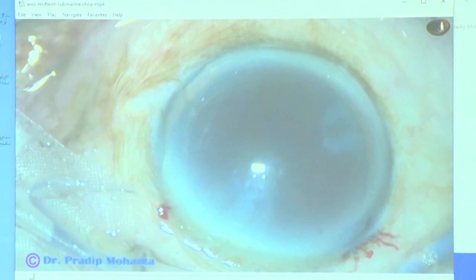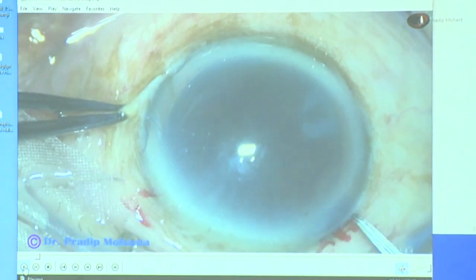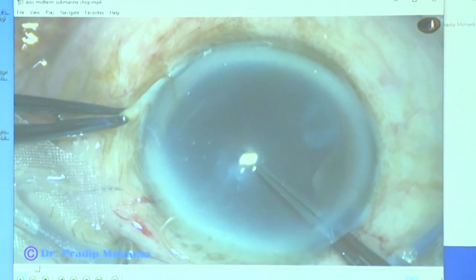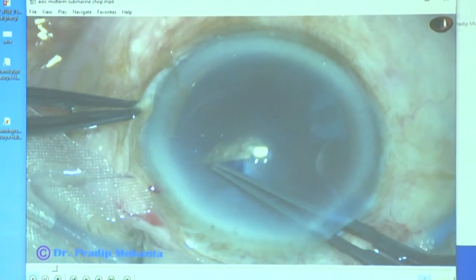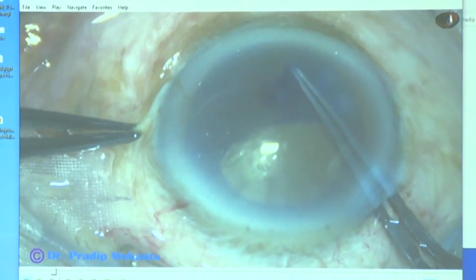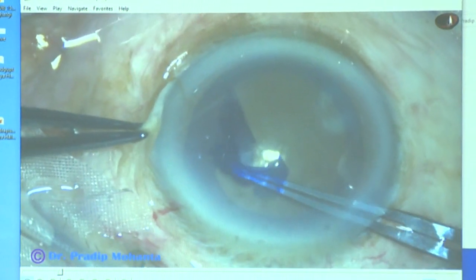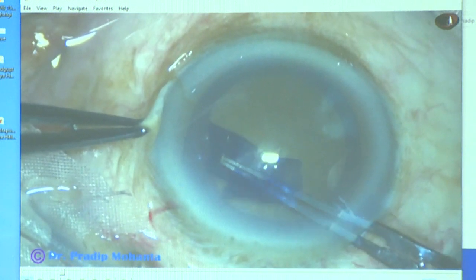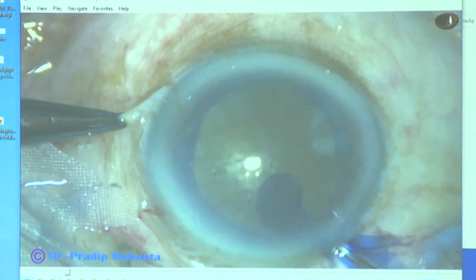For submarine chop, after making the incisions and for better visibility, applying some visco over the cornea, we need to do a large rhexis. Size of the rhexis should not be less than 5.5 millimeter. I usually do a 5.75 to 6 millimeter rhexis. I usually use a utrata forceps. It depends on what you are habituated to. If you are using a needle all the time, it's fine. So with utrata forceps, I have done a large rhexis.